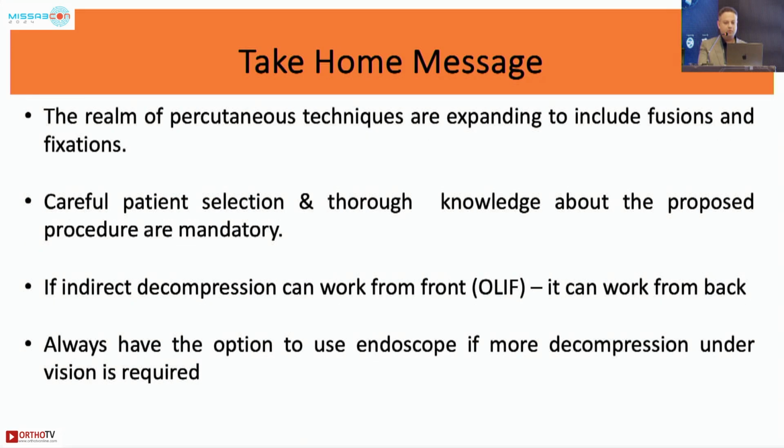So the take-home message: the percutaneous techniques are expanding to include fusions and fixations, as every one of us has been showing, right from thoracic to big cages now. Careful patient selection and thorough knowledge is mandatory, and the indirect decompression can work from the front, so it can work from the back as well. And you always have an option to use the endoscope to do a direct decompression in the cases which require it.